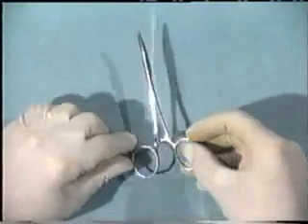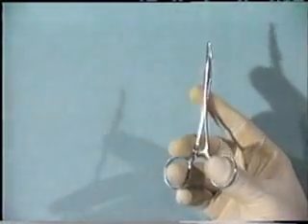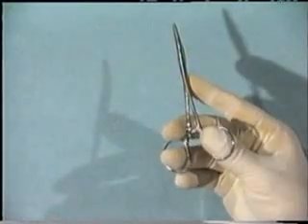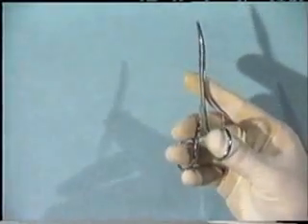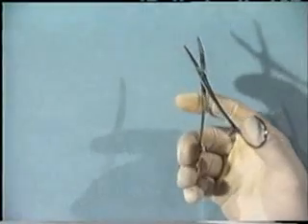Now, let us consider the hemostat. Correct handling of the hemostat is critical. Pick it up much as we did with the scissors, using the distal phalanges, and, as one is opening them, put pressure on the thumb against the ring finger and middle finger, and then the hemostat opens gently in a controlled manner.